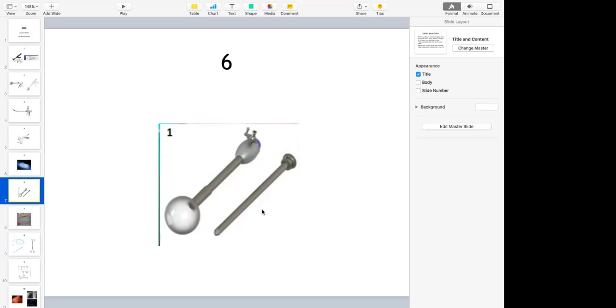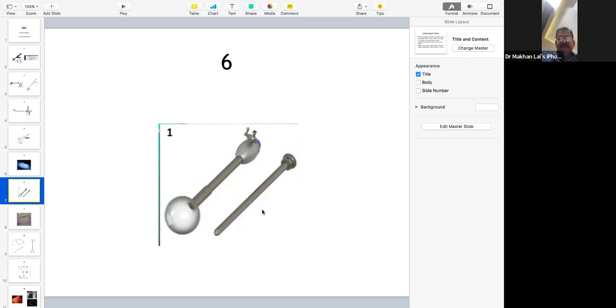And from there, you may be asked, how do you sterilize the trocar and cannula? Because in laparoscopic procedures, port site infection is dreaded. Previously, we used to clean the instruments, put them in glutaraldehyde and then in a formaldehyde chamber, and wash them again before the procedure and use them. But to ensure that there is no port site infection, this is a metal, and I'm not talking about the balloon trocar specifically, any metallic trocar and cannula, how can you sterilize? What are the newer gadgets available in the theater?